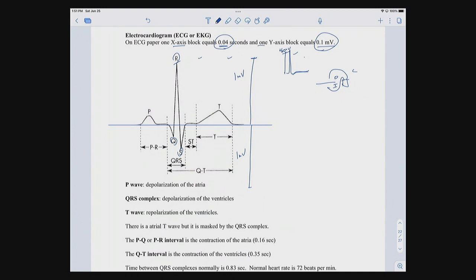You're looking at something else, and again, I will get into that later, walking you through why the pen on the paper moves up and why the pen on the paper moves down when you're doing an ECG. So that's coming, and I'm just going to have to ask you to be patient on that. But my big point is, this is not an action potential. What you're looking at here is the change in the electrical field of your body fluids in response to a depolarizing event of the heart.